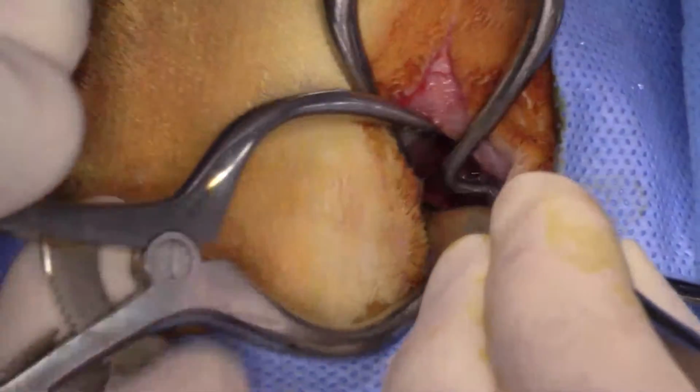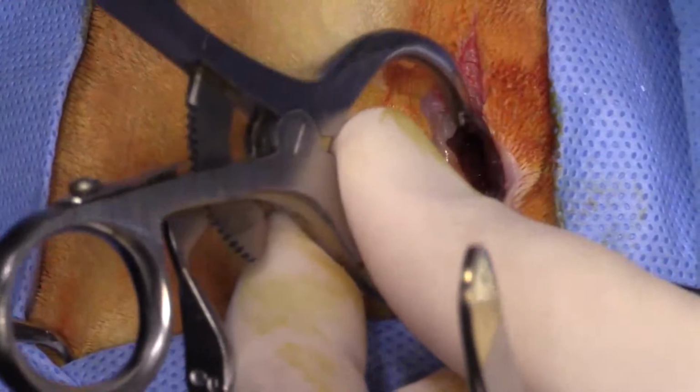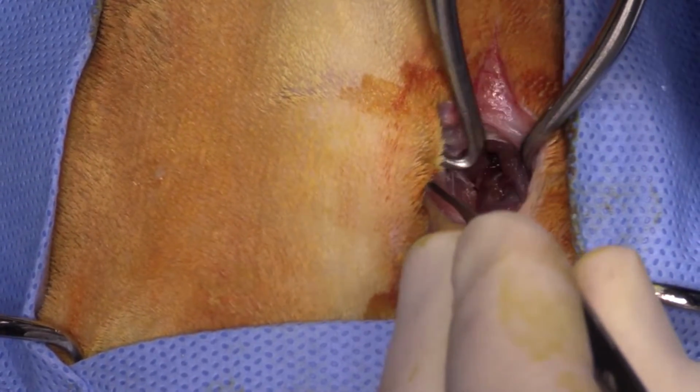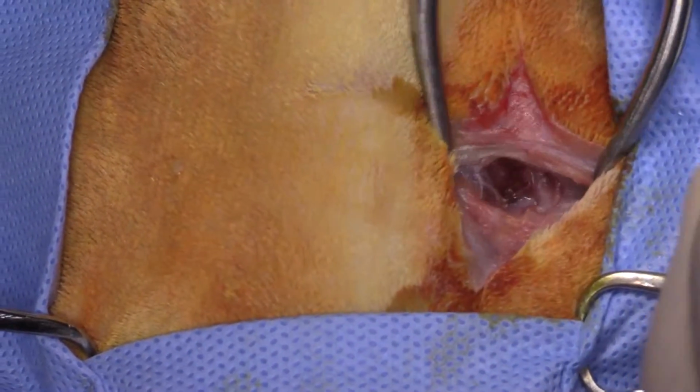All right, so I'm removing my Gelpi retractors. I'll make an effort to close some of the muscular layer on my way out here.